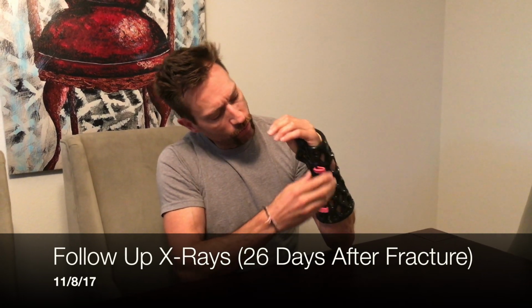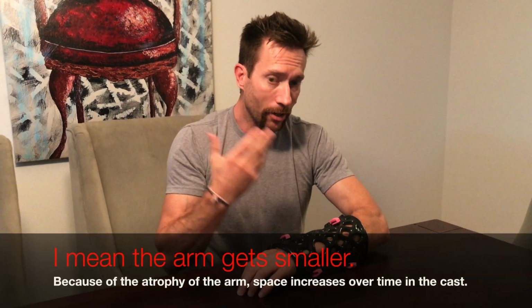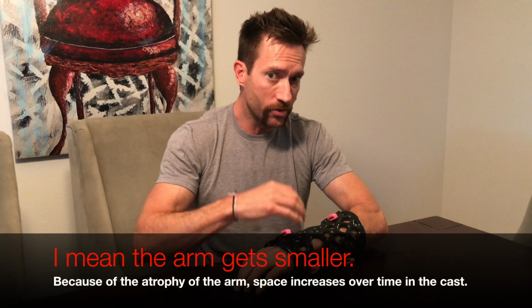And I'm going to show you what I've done to remedy that, which is if you end up getting one, it's going to get bigger anyway because your arm atrophies. And we also think that it's quite possible that mine was a bit too swollen when we measured as well. So that makes it equally bad. The arm is getting smaller, as well as the arm was a little too big when we measured.